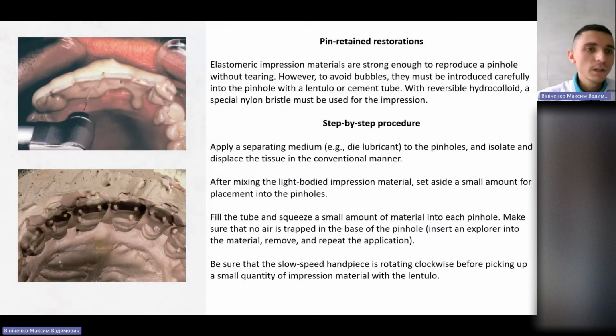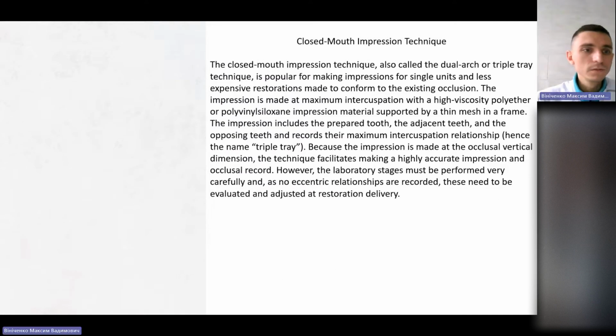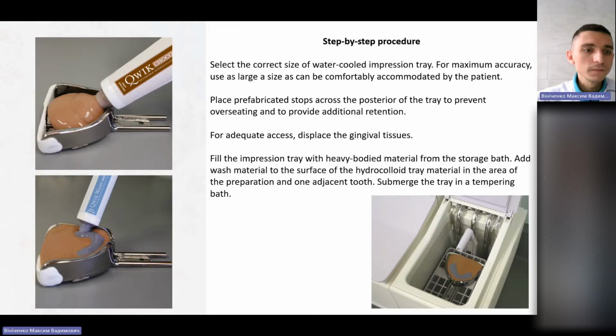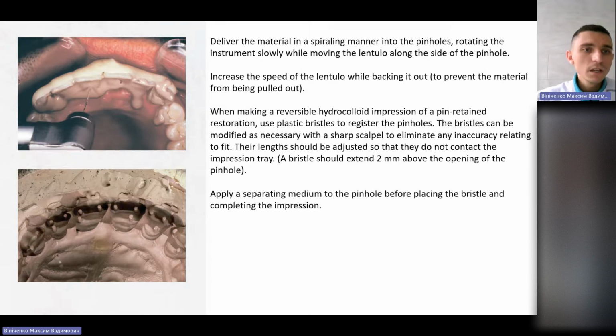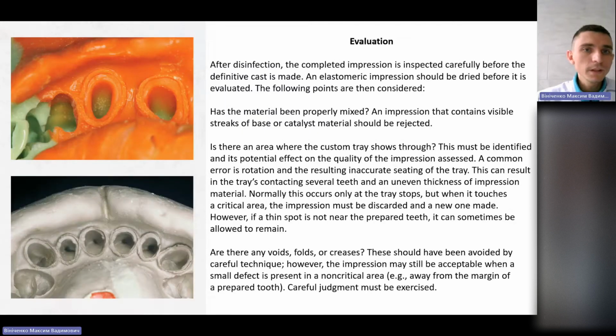Otherwise, you need to make a full impression from the maxillary and from the mandibular. Next, disinfection and evaluation.